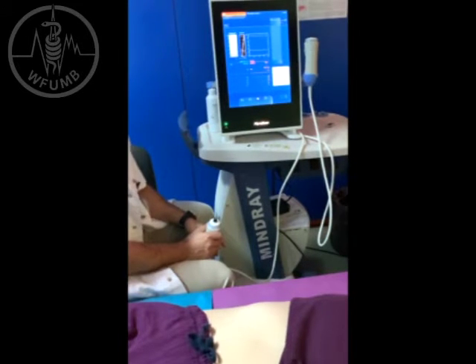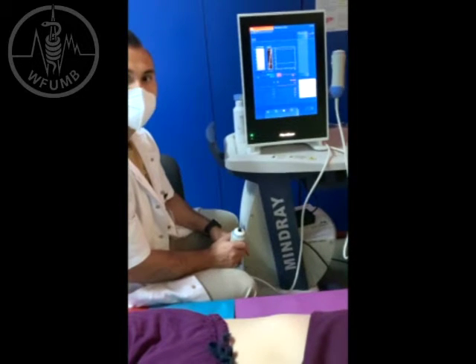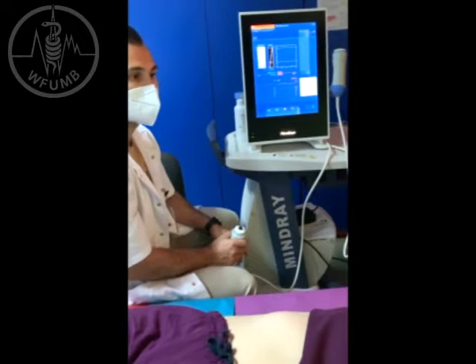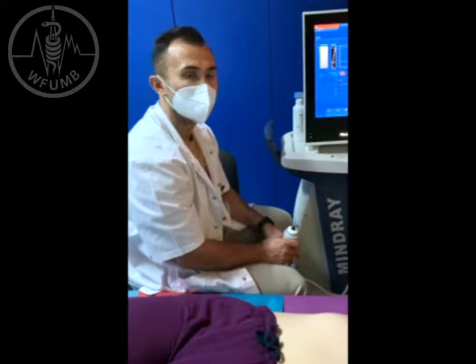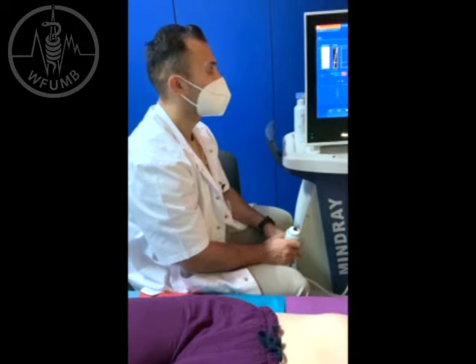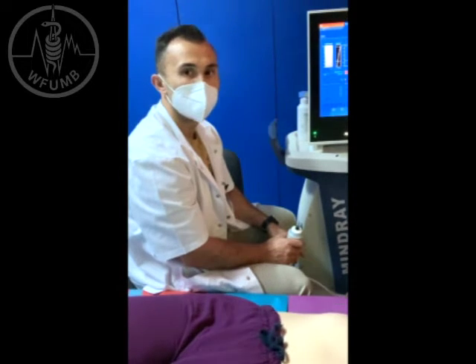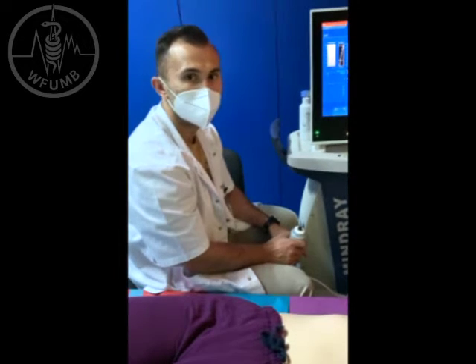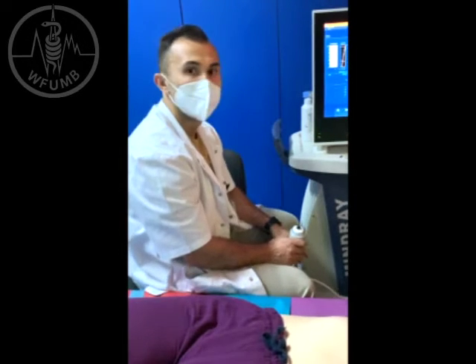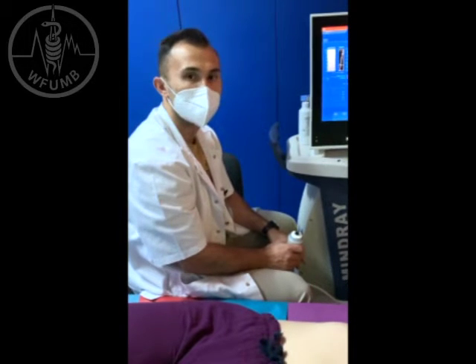As many of you probably know, transient elastography was the first elastographic technique released on the market over 10 years ago, and since then many published papers have proven its value in the field. It was introduced as an alternative to liver biopsy with very good accuracy for ruling in and ruling out advanced fibrosis and liver cirrhosis. Today, I will be examining a patient without known chronic liver diseases.